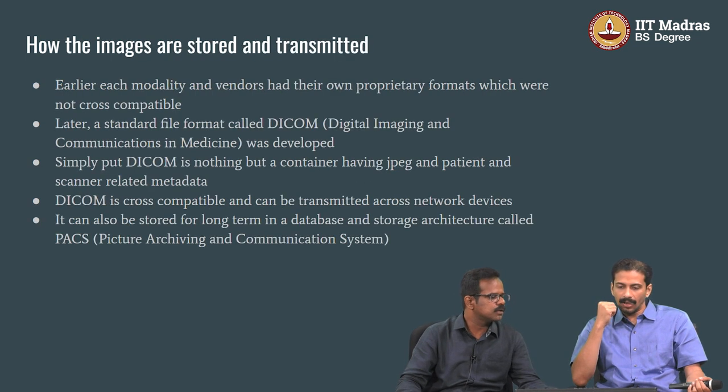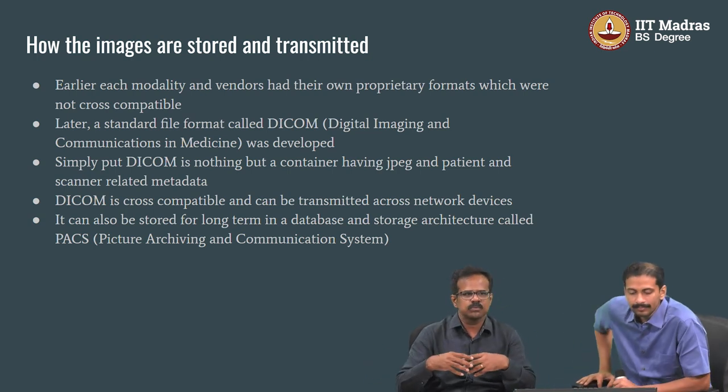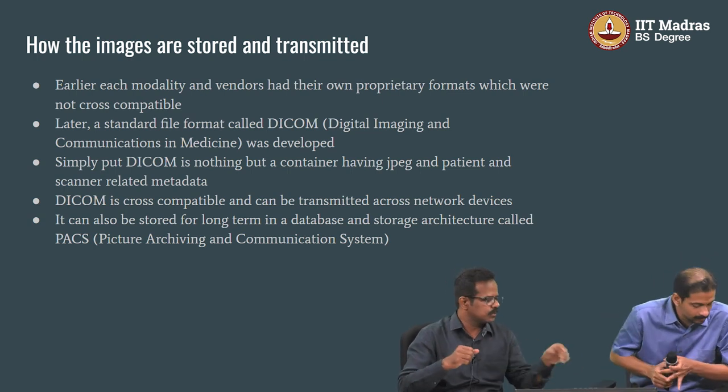Okay, we can complete. So, the next step is, we are acquiring so many images. How to archive them, how to retrieve them.